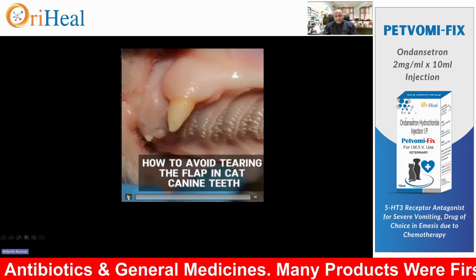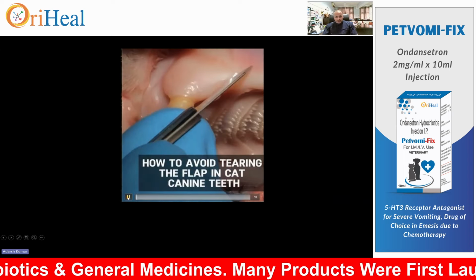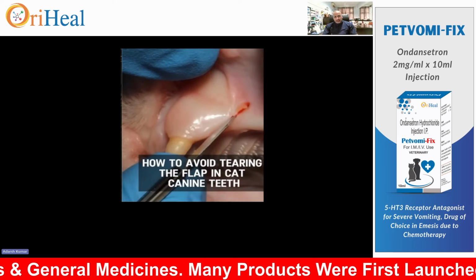So just see here, this is a cat. The incision is given.